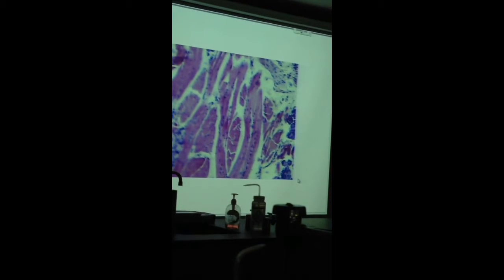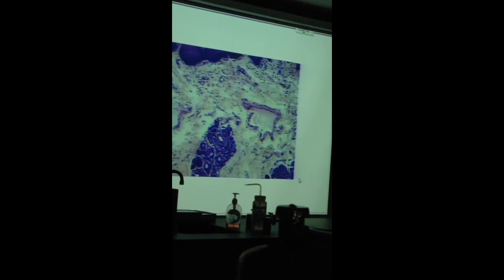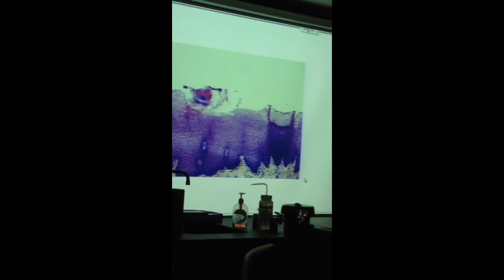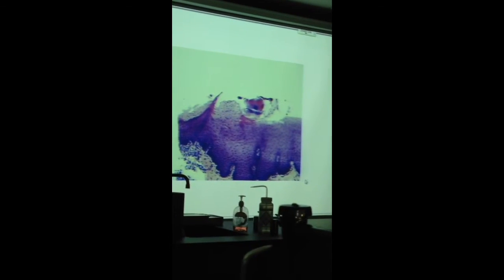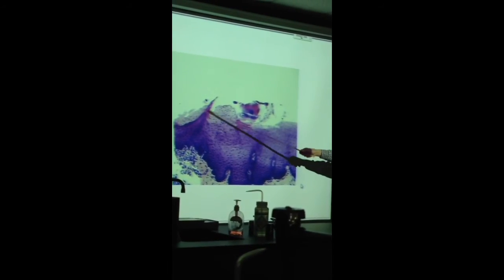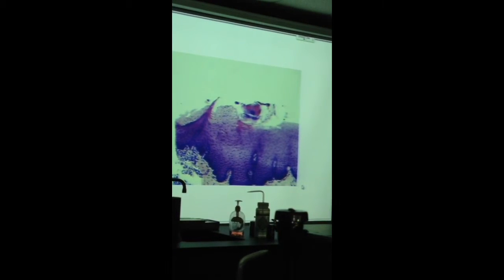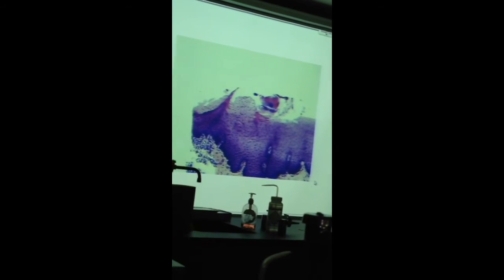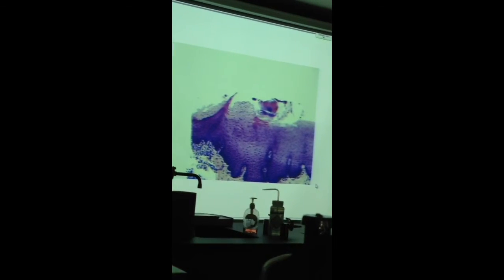By the way, let's go back to the filiform papilla. These are spine-like ones. See a couple here, and then you see this one over here on the edge. This is one place where you have keratinized stratified squamous epithelium, right here. So these little patches in the tongue where you have filiform papilla are actually keratinized stratified squamous epithelium. The rest of the tongue, your oral cavity, oropharynx, laryngopharynx, esophagus, non-keratinized stratified squamous.